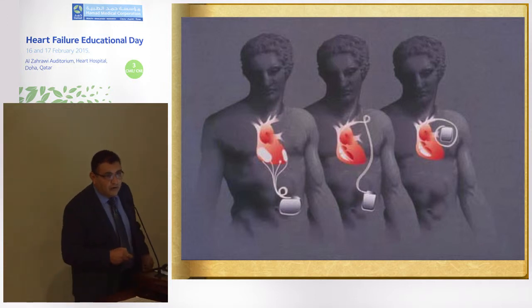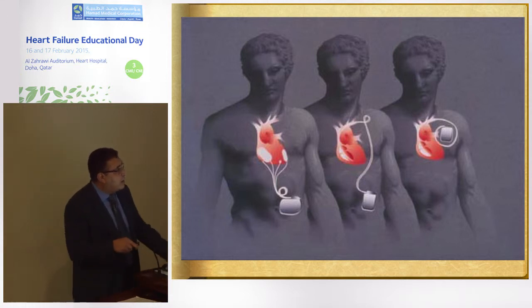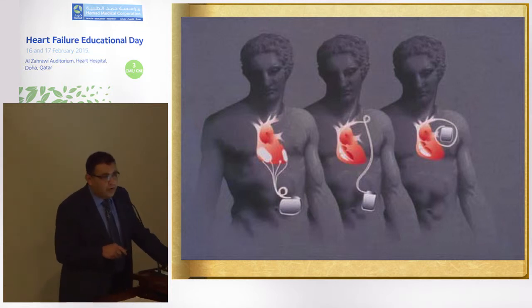The first device, implanted in the 1980s, used to be a huge device implanted in the intra-abdominal cavity. The leads were epicardial leads. They used to have a lot of problems, such as inappropriate shocks.